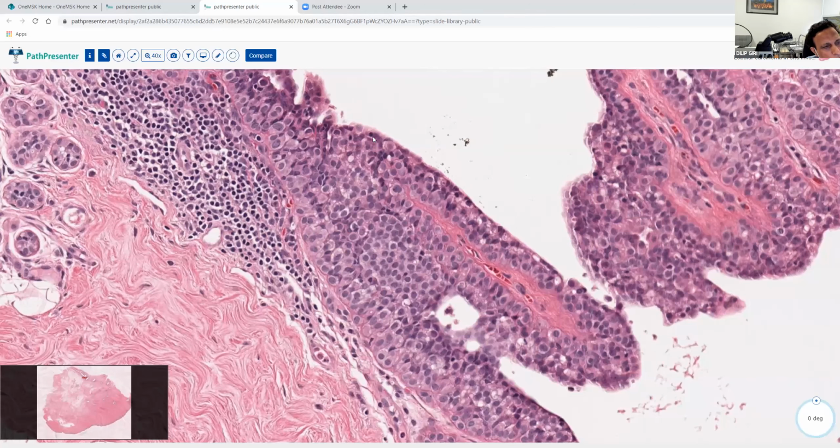So although a lot of them have been pushed to the surface, some of them get entrapped between these proliferating LCIS cells. And if these look unusual, like, here it is pretty classic appearance, but sometimes lobular carcinoma in situ may have a little unusual morphology. The cells can be larger, they may have more prominent nucleoli and stuff like that, right?